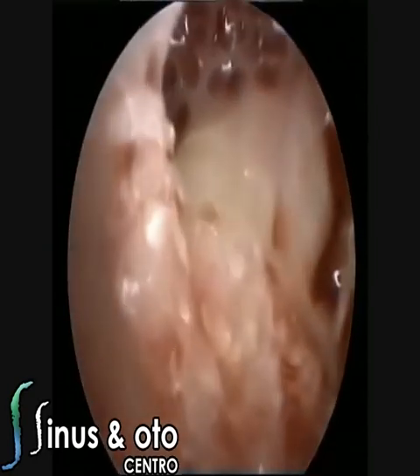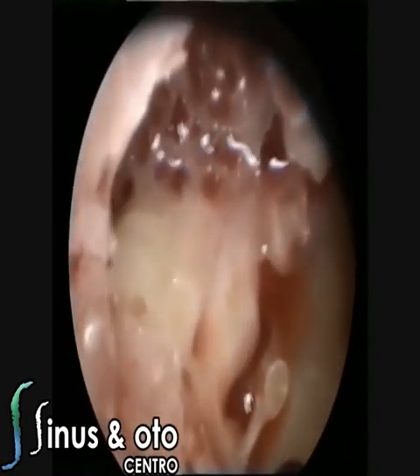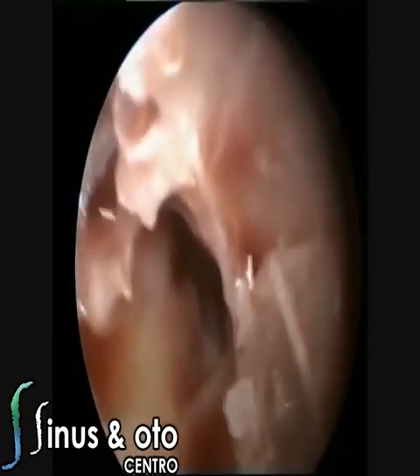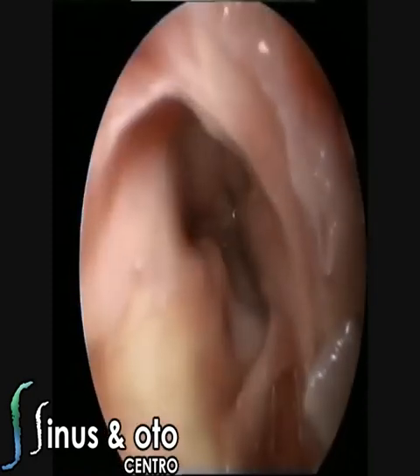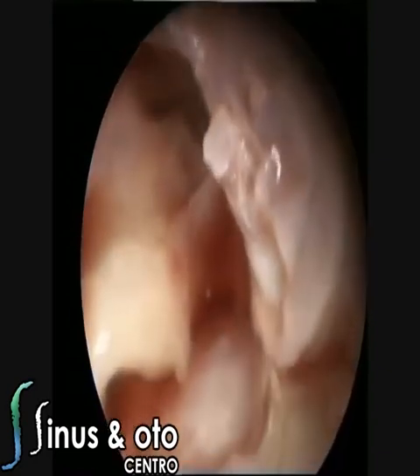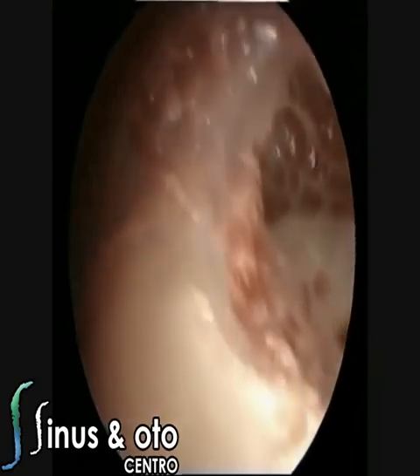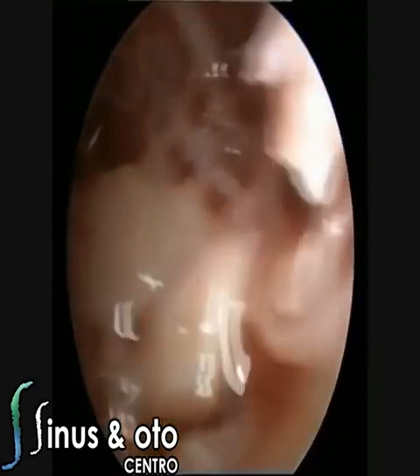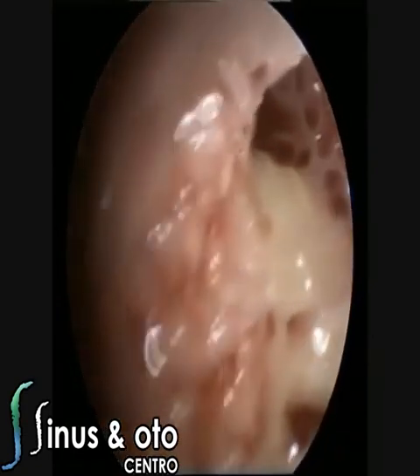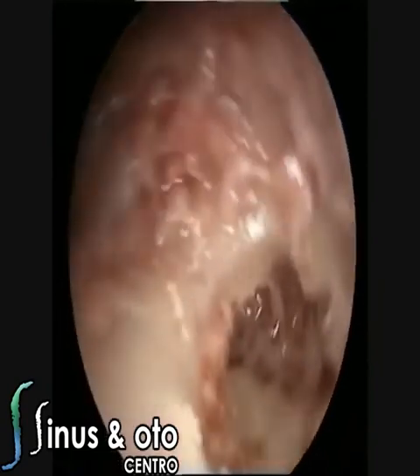So you have the facial recess, lateral semicircular canal, facial nerve, the mastoid tegmen, the mastoid antrum, and the anterior spaces, which are the supratubal recess, the canal of the tensor tympani muscle, and the eustachian tube over there. So it's a very nice tool to try to understand, and I hope you have liked this dissection and this understanding of the physiology of the middle ear. So thank you very much.